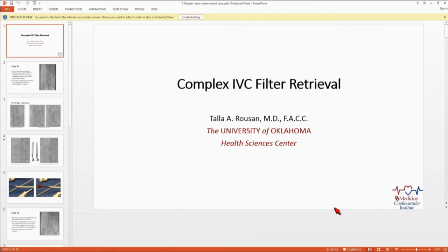I don't know if you need to do that, because with the IVC filter, the tip comes. This is the tip that can penetrate, but then the legs come out, and they will anchor. There's no way the legs are going to be compressed and go out. So I don't think you need to seriously keep following. He has had already 2 CTs, so I don't know whether I keep repeating them or not. I think he's fine. Yes, he probably is, though.